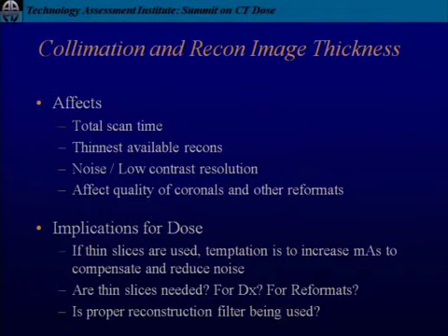But okay. Should we let one, just one final comment. We're not quite there yet. It's the same direction. I think we should, as a radiologist, differentiate the scanning thickness and viewing thickness. Scanning thickness, which is the physical number, and the viewing thickness. How thick is the slice we view?